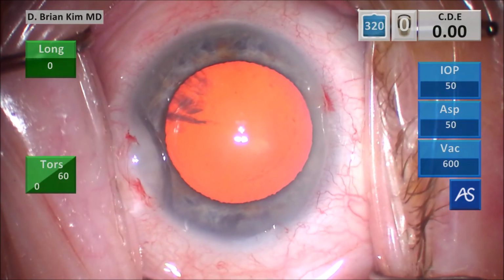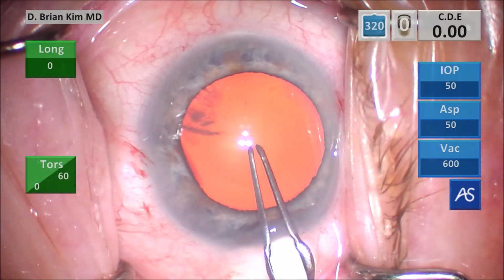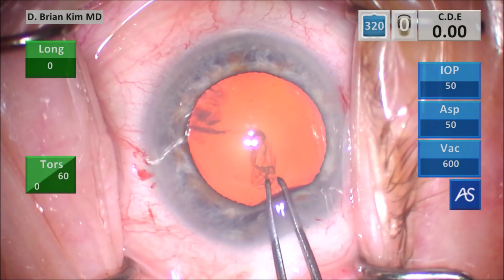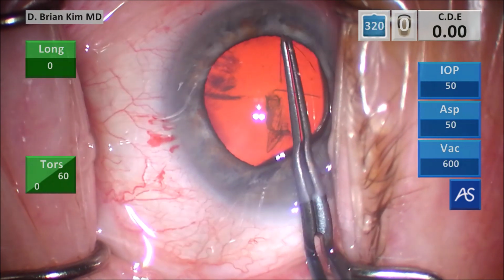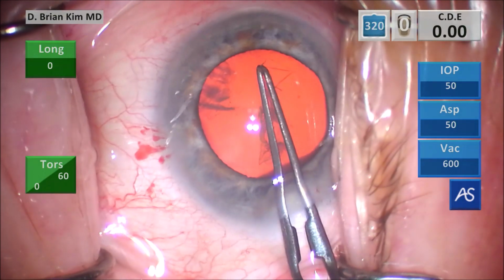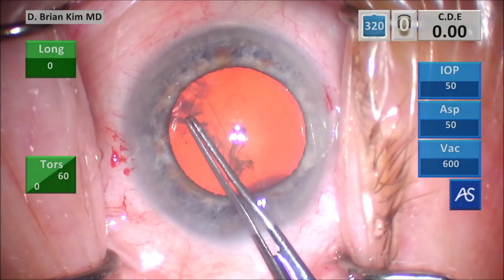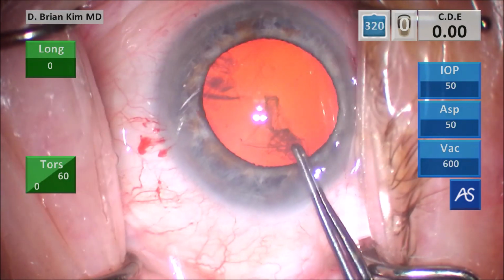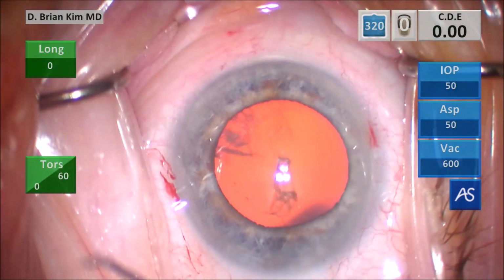I push some more viscoelastic in, place the teeth of the forceps sideways, go in, puncture the center, pull down, grab the right side of the tear to create a flap going around circumferentially, trying to use the mark that I made as a guide for the size and center of the rhexis. Go ahead and burp some viscoelastic out, and this is the capsular fornix hydrodissection technique.